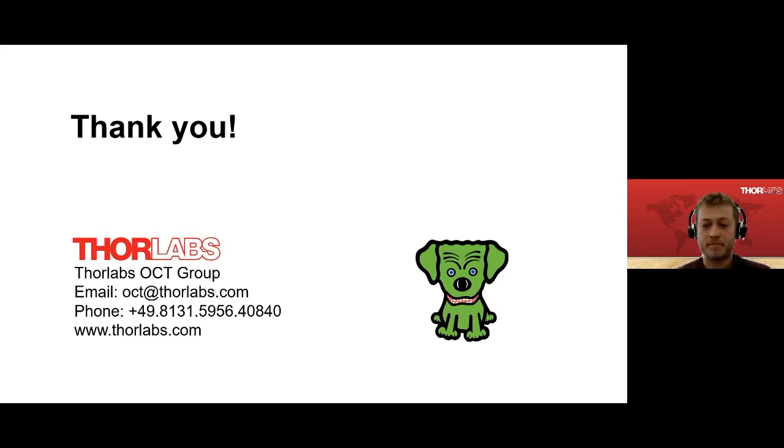And maybe one more addition. Typically in OCT, we use near infrared light, which will also give you a worse lateral resolution than the visible light that is typically used in confocal microscopy.